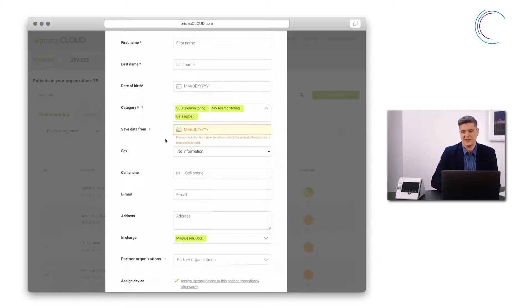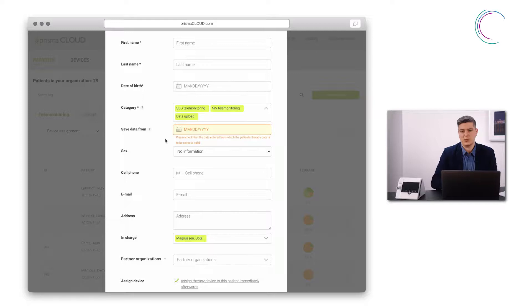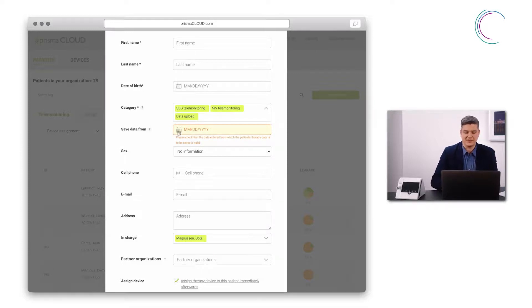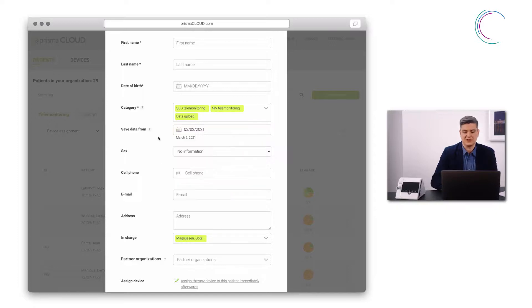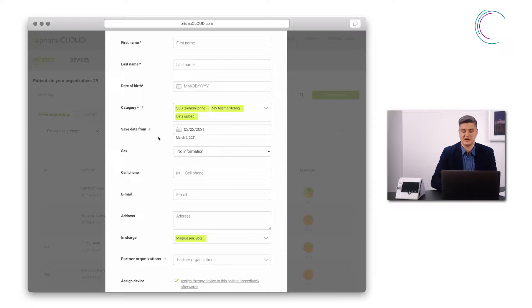Save data from defines the date from which data is stored within Prisma Cloud. I can define this here. My recommendation is to choose the starting date of the therapy.